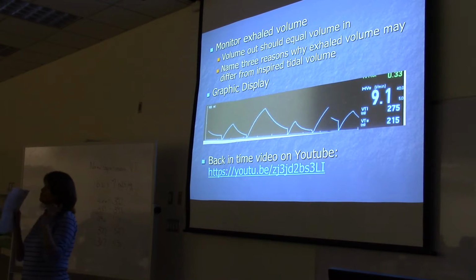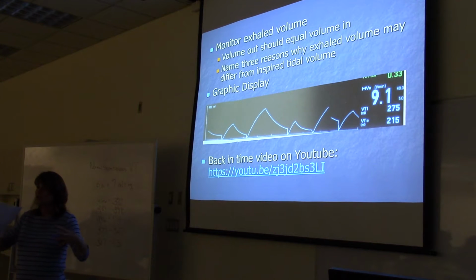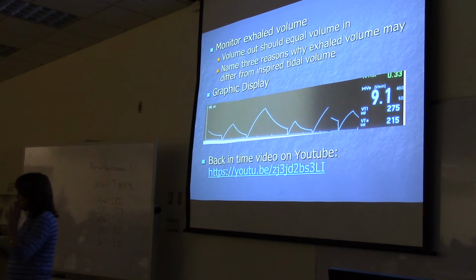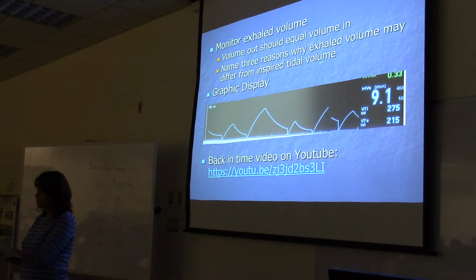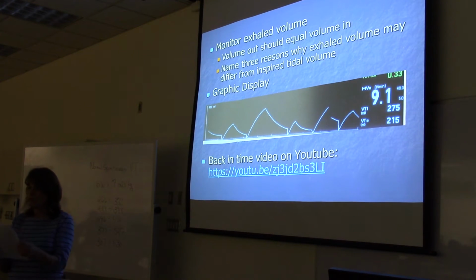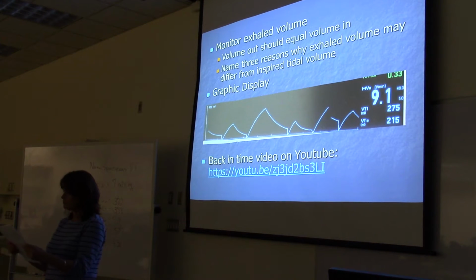So typically you should put in 500 and see about 550 mLs come back, only because the heat and the moisture expanded it. So that makes sense? Warmth and humidity expand a volume. And then the second one, air from a previous breath is being exhaled. Would that correlate back with the incomplete exhalation? Yes.